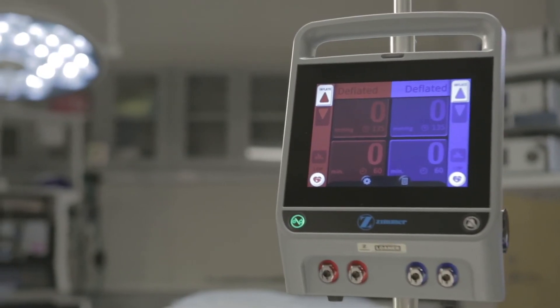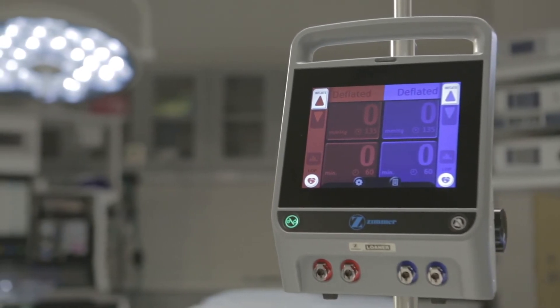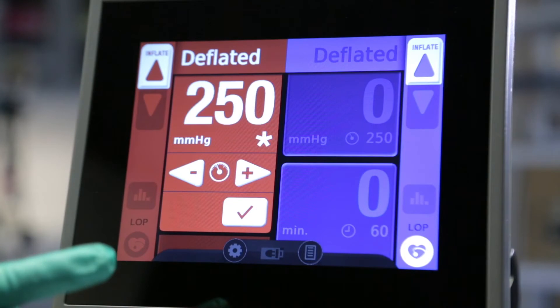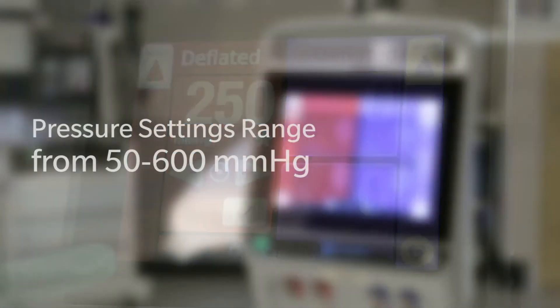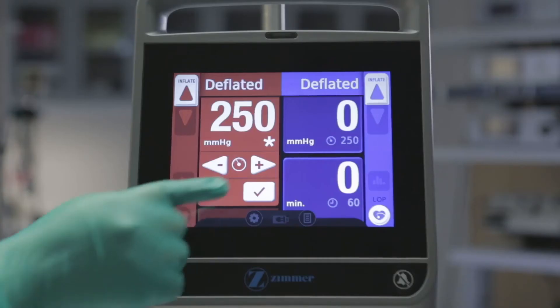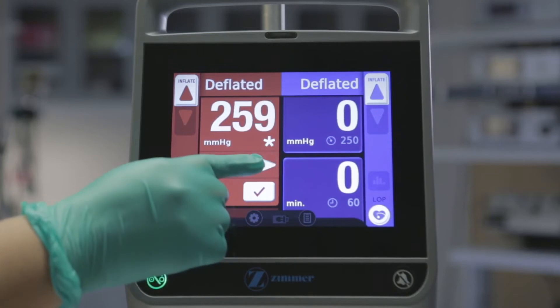The default pressure and time settings are held in the machine's memory and will return whenever the machine is powered up. Tap the pressure tile to display the set pressure. A new tile appears with a pressure display and arrows. The pressure display will show the current default setting. The pressure settings range from 50 to 600 mm of mercury. Tap the arrows to change in increments of 1, or tap and hold the arrow to make changes in increments of 5.